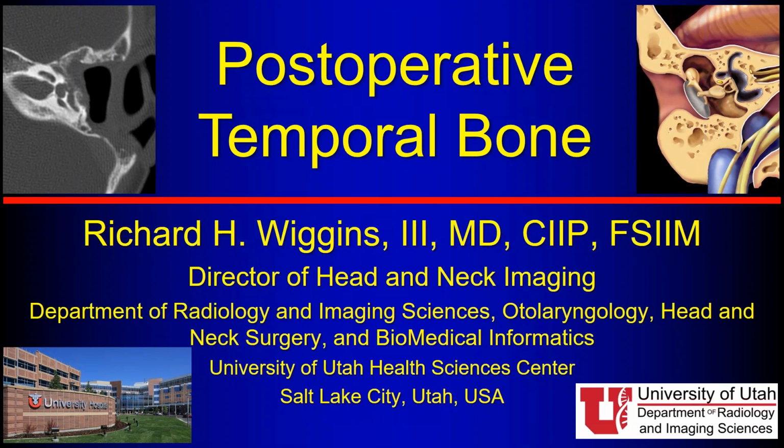We try to differentiate that from inflammatory or infectious changes. The ADC values, as we see with malignant tumors, things that are hypercellular are more likely to be malignant, therefore they have low ADC values in those cases. That's something that we've looked at in several different body parts to try to help differentiate benign from malignant. So yes, I use ADC more and more in the extracranial head and neck and the temporal bone, and I'm actually using it more than DCE and some of the other fancier, more advanced imaging techniques.